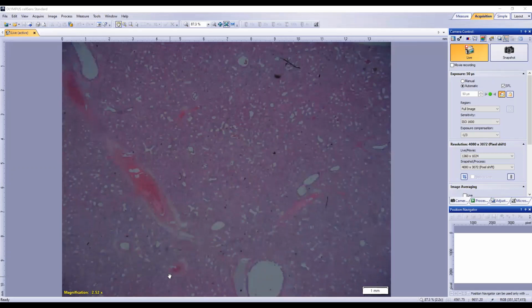Cool. So this kind of process is what's going on in their heads in a fraction of a second when we first see the slide, and we're automatically including or chucking out possibilities based on that. So we'll stick around at this power just a fraction longer, and then in terms of this particular slide, we've probably squeezed as much as we can out at this power, and we'll actually break our rule on the very first session and go down a little bit closer.